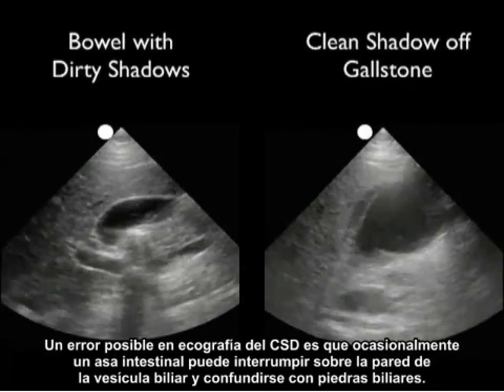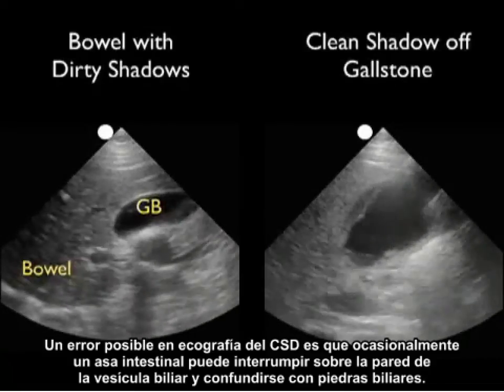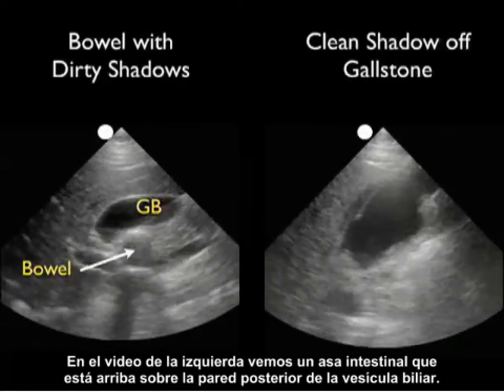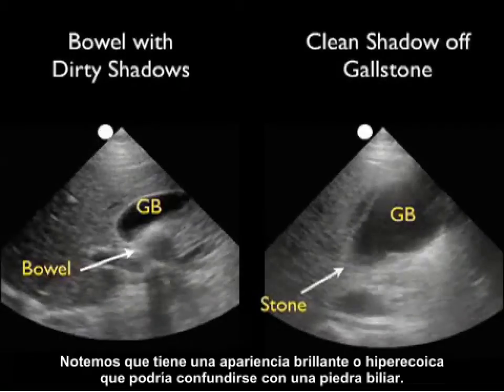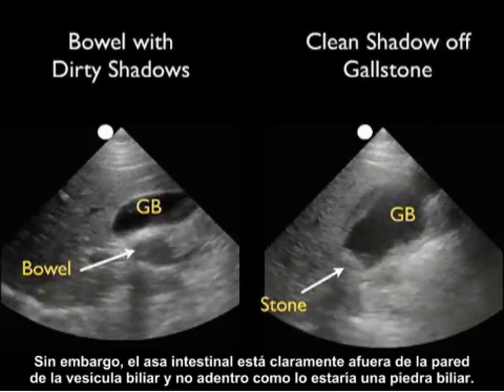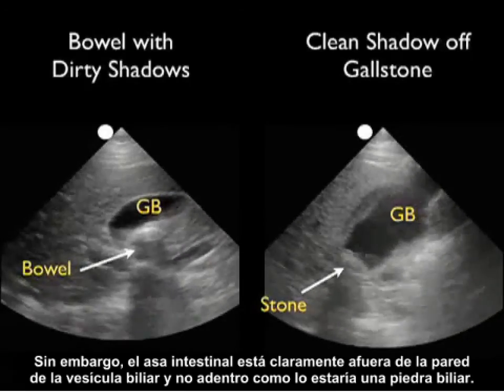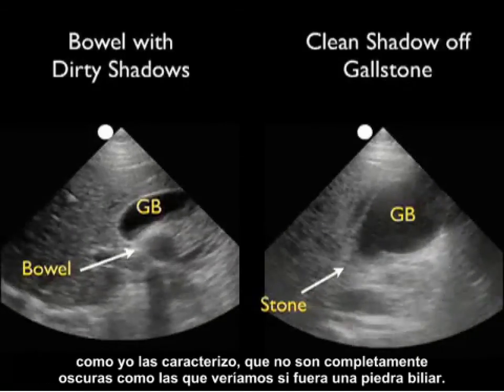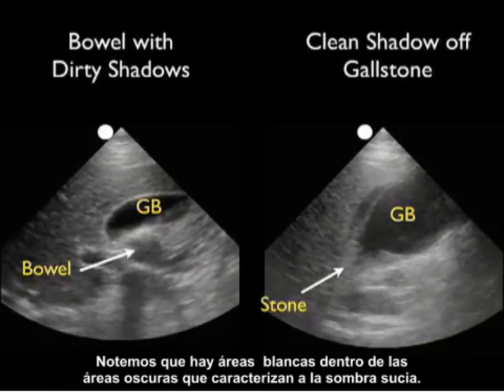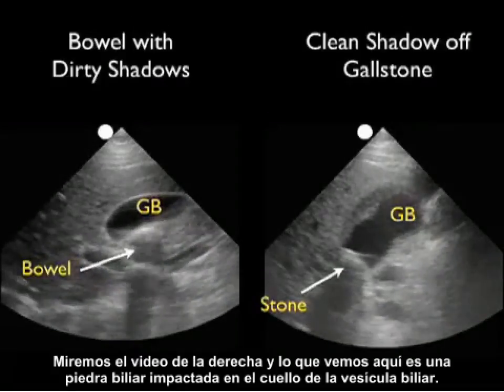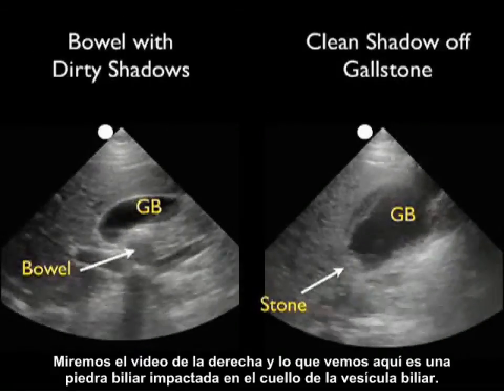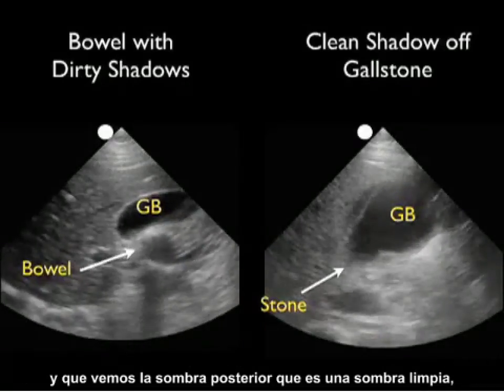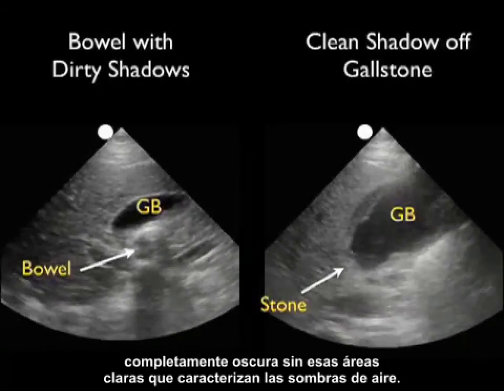One potential pitfall in right upper quadrant sonography is that a loop of bowel may come right up against the gallbladder wall and be mistaken for a gallstone. In the video clip on the left, a loop of bowel is right up against the posterior wall of the gallbladder — it has a bright hyperechoic appearance that could be mistaken for a gallstone. However, it is clearly outside the gallbladder wall. Also, the shadows off the air-filled bowel are dirty shadows — not completely dark, with areas of white within them. In the clip on the right, an impacted gallstone at the neck has a hyperechoic appearance, is clearly within the lumen, and casts a clean shadow — completely dark, without the light areas that characterize air shadows.